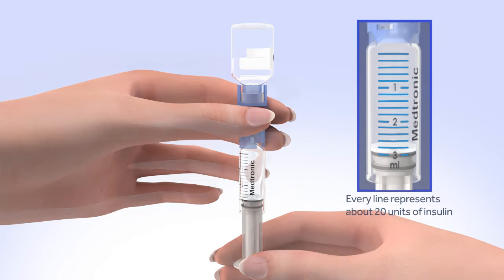Remember, one to three hours after inserting a new set, you should check your blood glucose. Checking your blood glucose is the only way to confirm your infusion set is properly inserted and that you're receiving insulin.